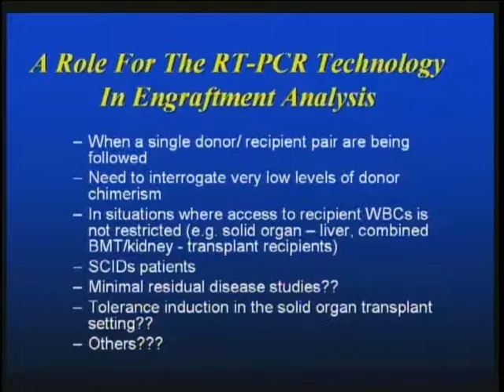So given all of this, is there a place for this new technology in engraftment analysis? I believe there is, but in very restricted settings. So here are a few things that I could come up with in terms of where we could use this assay. One is if you're only looking at a single donor recipient pair and you're not restricted in terms of how much DNA you had pre-transplant from the recipient or from the donor and could just run this over and over again, you'd be fine.